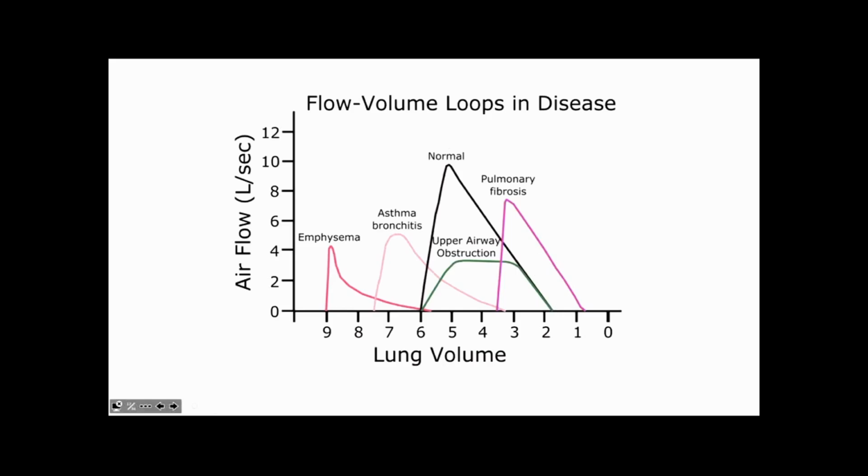In a patient that develops restrictive disease, they can't get air in. So what will happen is they'll start here at about 3.5 liters instead of 6 liters. Although when you do the test, it'll line up on the spirometer because we don't have residual volume. This is offset to make it clear to you what's really going on.